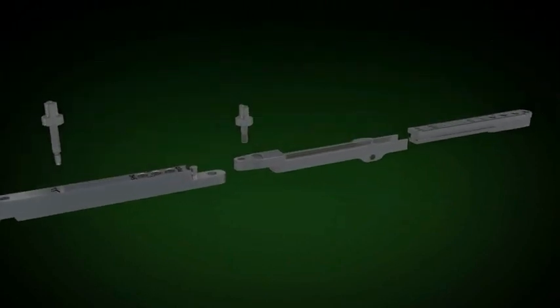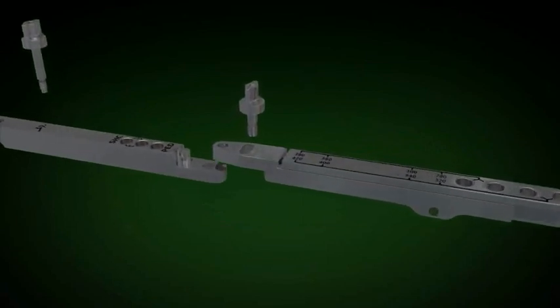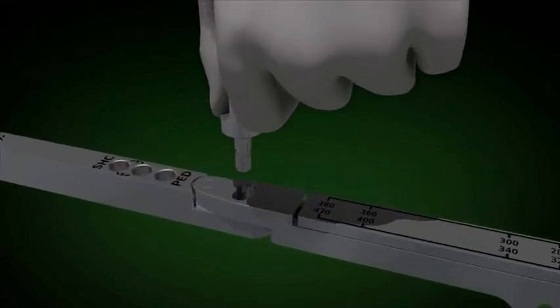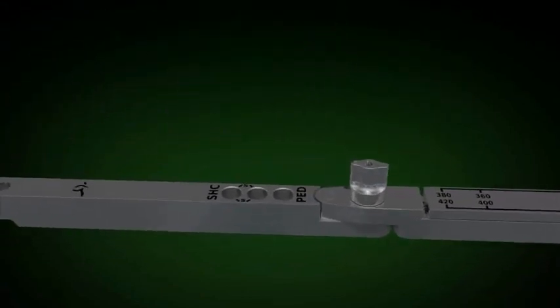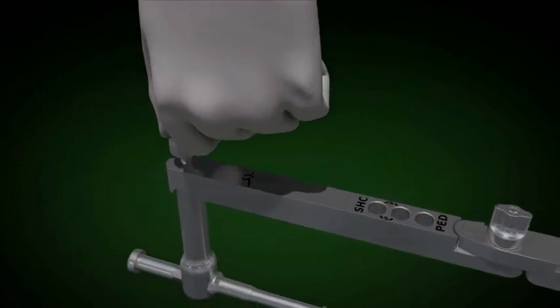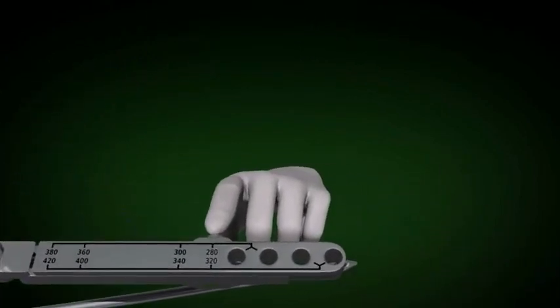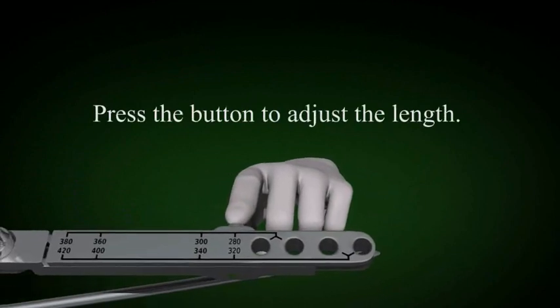We then set up the target arm so that the distal interlock can be obtained. Place the distal end into the groove of the middle extension, then attach the middle extension to the proximal extension. The proximal extension is then attached to the L handle using the shoulder bolt and tightened. Note the button that can be pressed to change the length of the distal extension to match the size nail you intend to use.